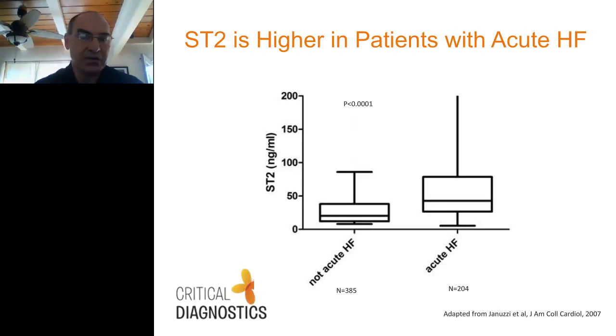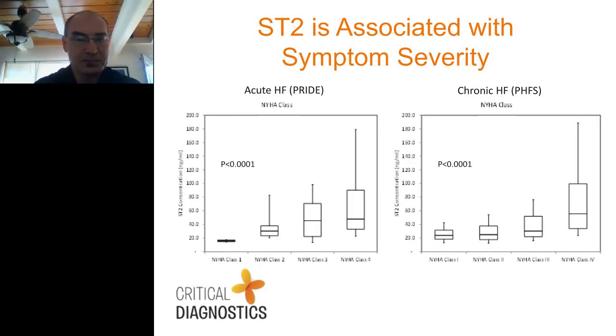So going back to, again, that first study, now using our validated test, we see that we get exactly the same profile, that ST2 concentrations are higher in patients that have diagnosed disease, heart failure, than in patients who have symptoms but do not have diagnosed disease. So again, the potential diagnostic but not a powerful diagnostic.